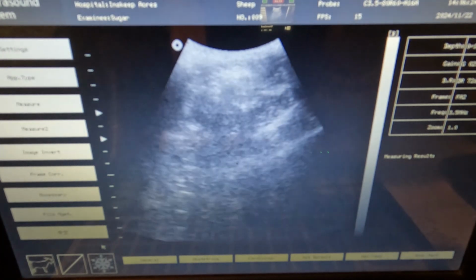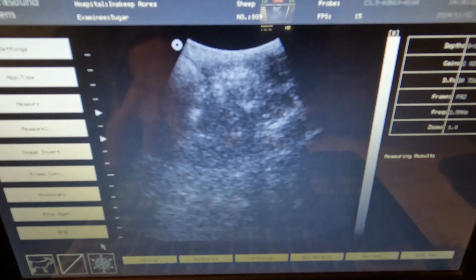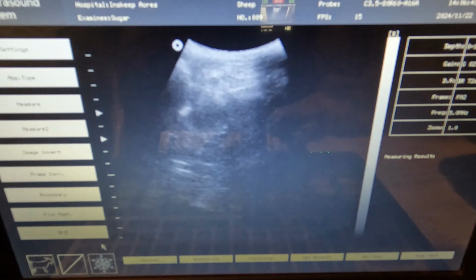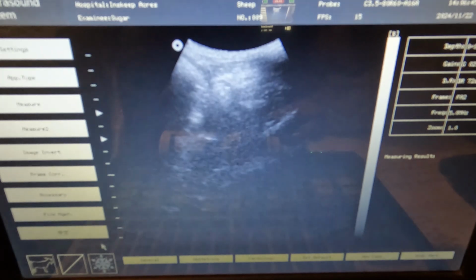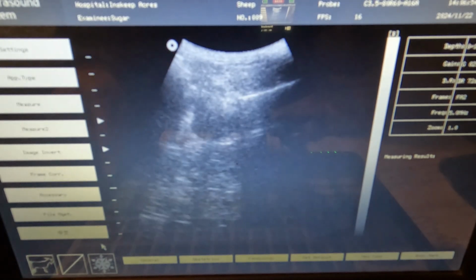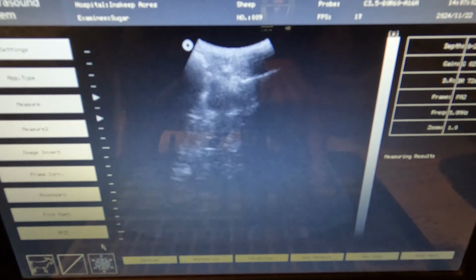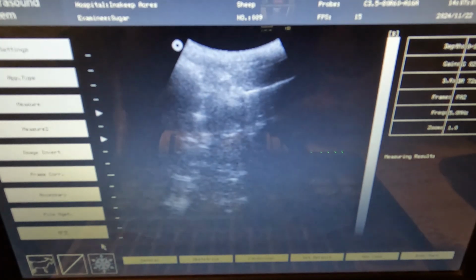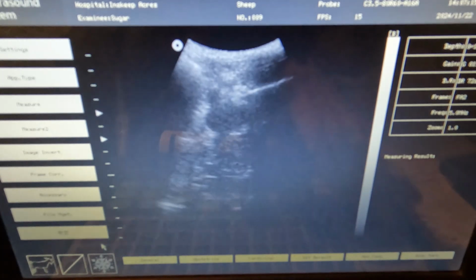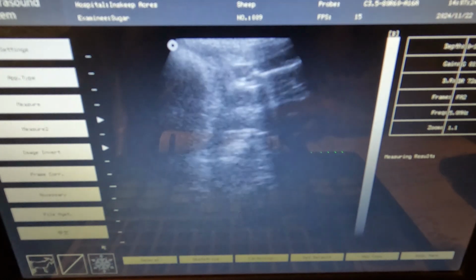Frequency. So it looks like 5. It says it should be reduced for large animals, so I think I want my frequency up like that. That helps a little bit. And then depth. Can't zoom there. And then gain lightens and darkens. Oh, disappeared. Let's try that. That looks a little better.